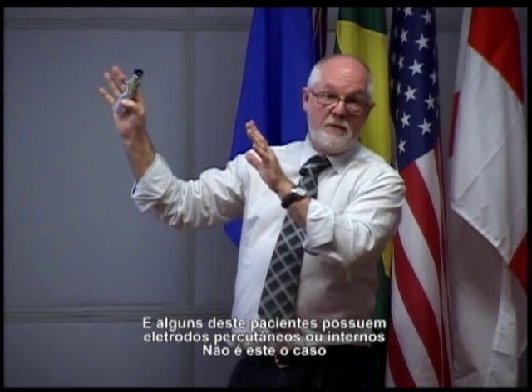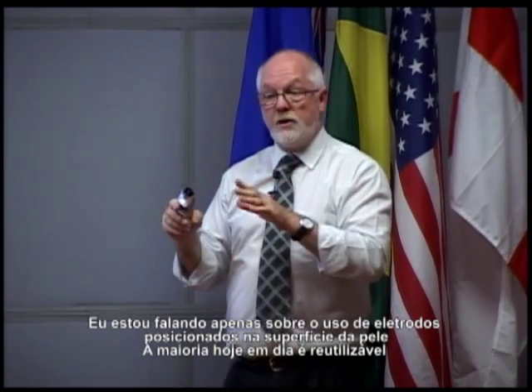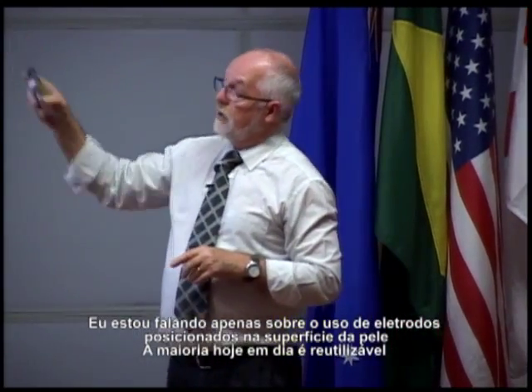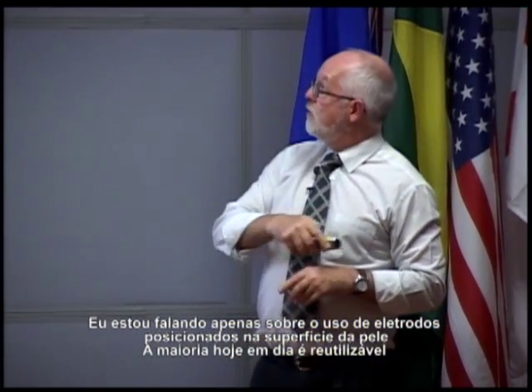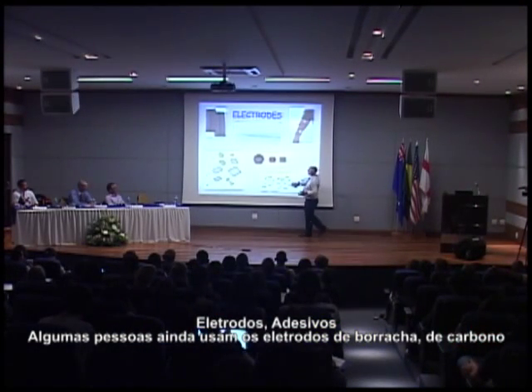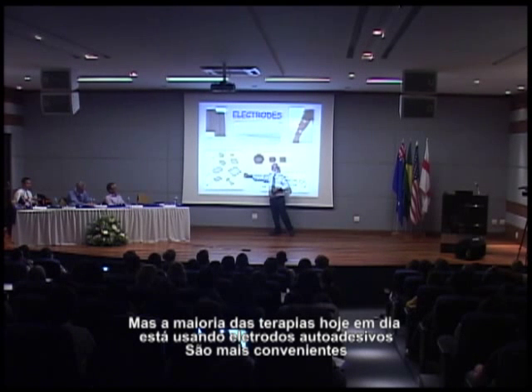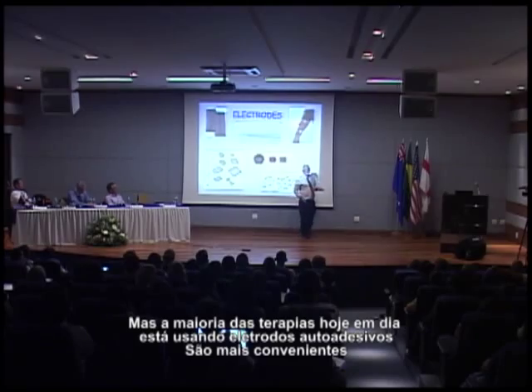This is not the therapy I'm talking about. I'm just talking about using skin surface electrodes. Most of those these days are reusable electrodes. These are the sticky patches we use. Some people still use the rubber electrodes or carbon rubber electrodes, but most therapists these days are using self-adhesive electrodes. They're most convenient.